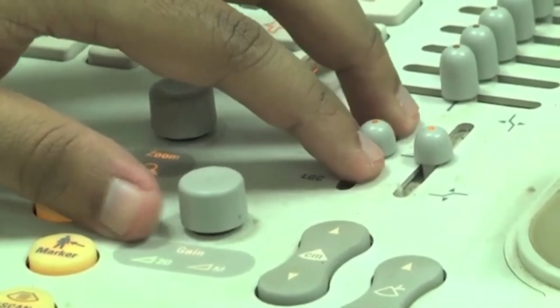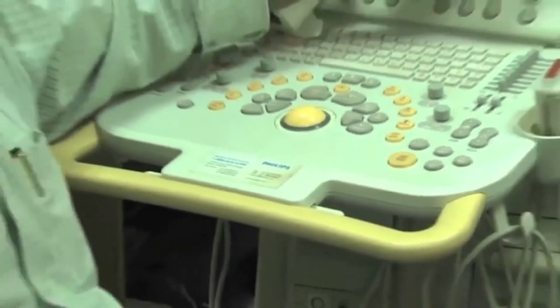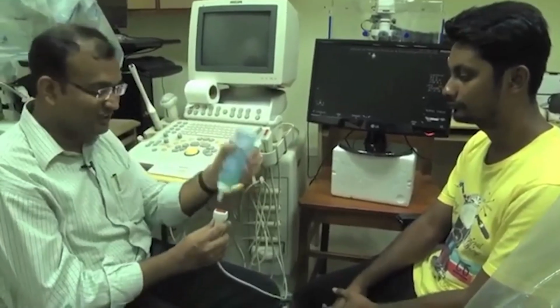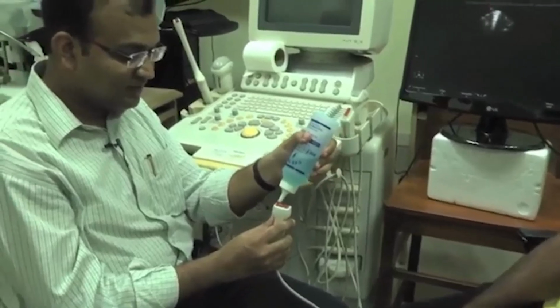Now without taking much time, what I would try to show is one of these probes and how we are using it. We have our volunteer over here, Devargo, who is interestingly doing his PhD also on ultrasound, and today we are going to perform an ultrasound on him. He has volunteered to have his carotid imaged.